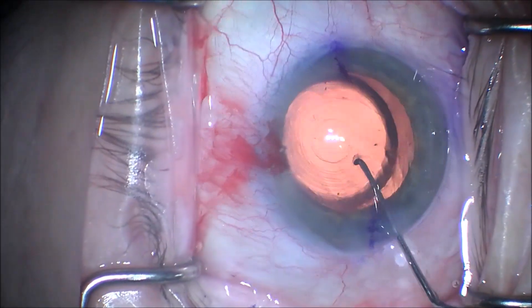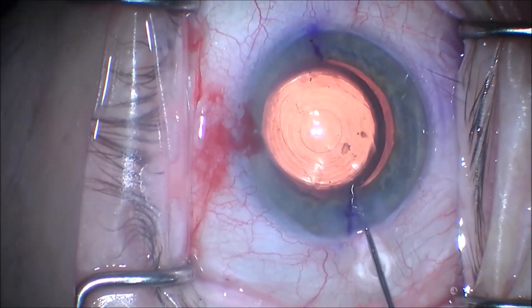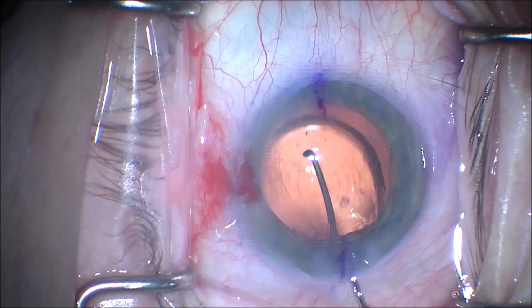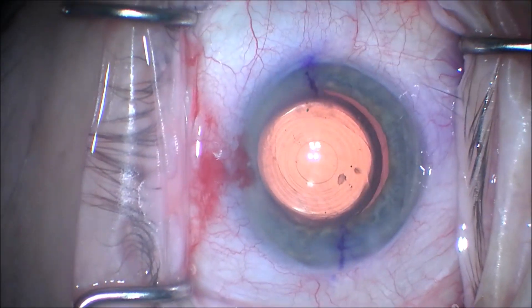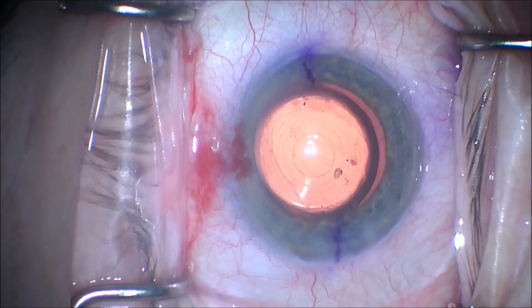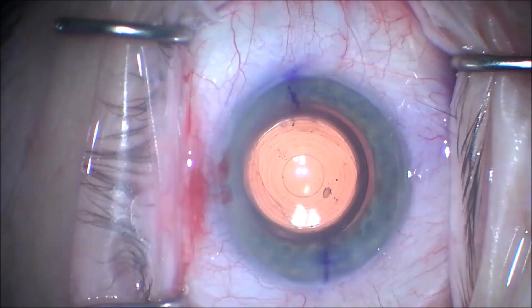We're going to get the axis of astigmatism of the toric intraocular lens implant matched with the corneal markings. We, of course, double check these with an ORA optical refractive analysis system for our final positioning.